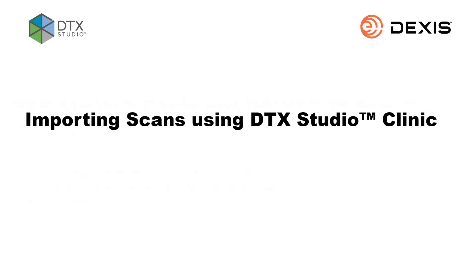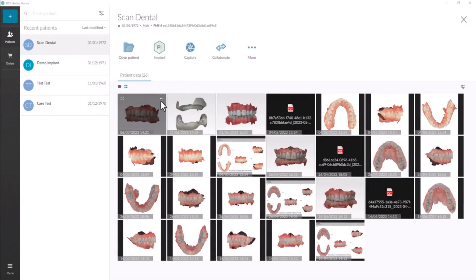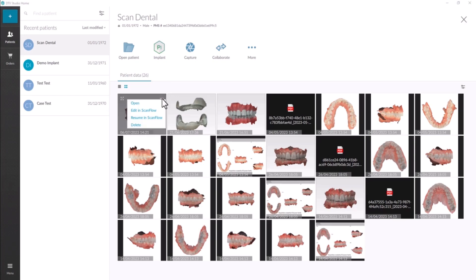Importing scans using DTX Studio Clinic. In the imaging software, open the patient's file. Click the three dots in the upper right corner on a previously saved scan. In the drop-down window, select Resume in IS ScanFlow.